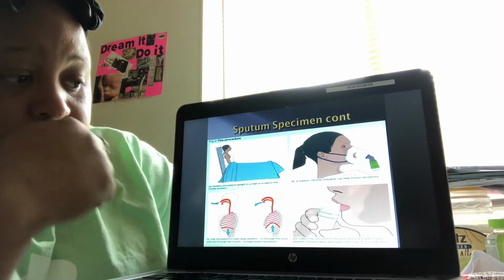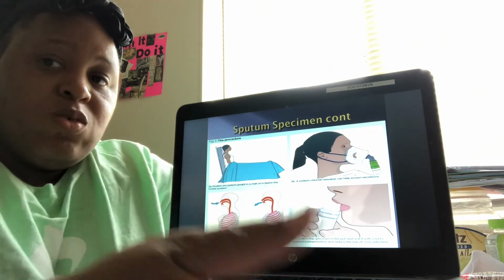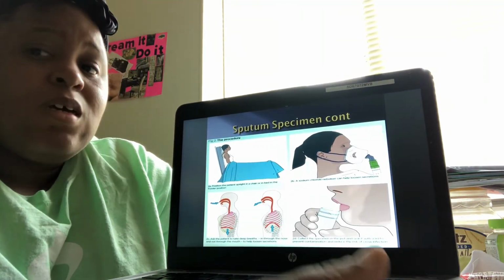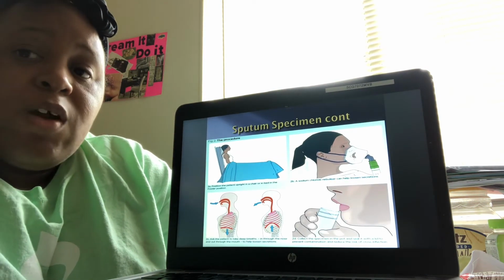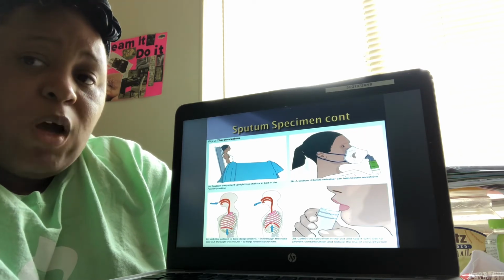Once they feel that it's up, bring the cup up to them, tell them to spit into the cup, making sure that it is thick, not thin. Once they've done that, close the top, verify name and date of birth once again, take off gloves, wash hands.